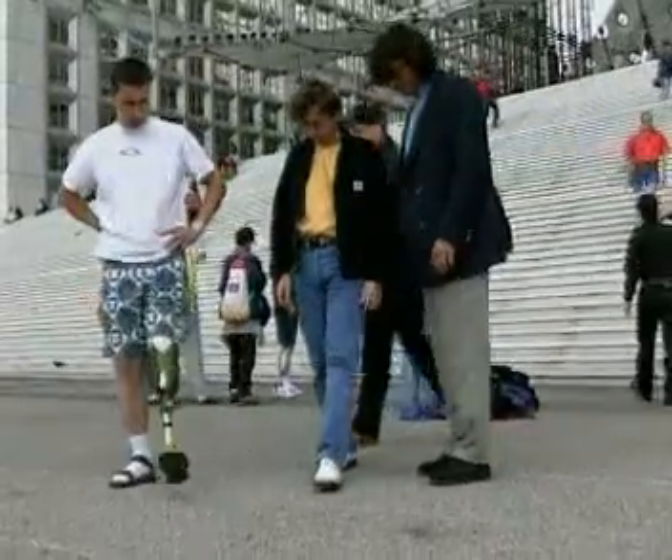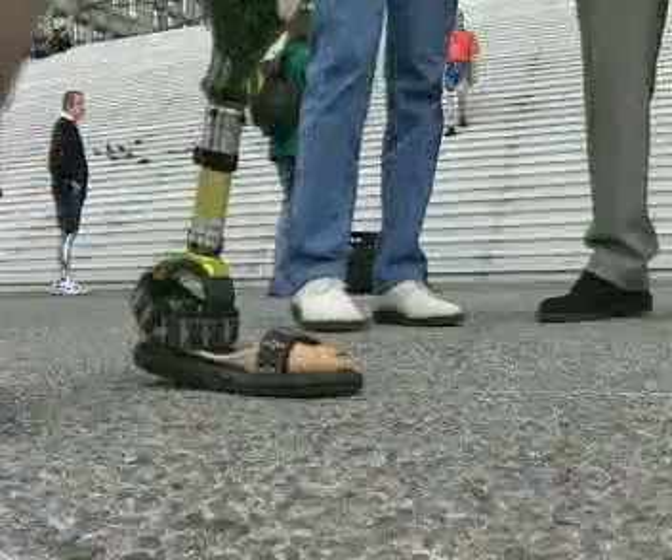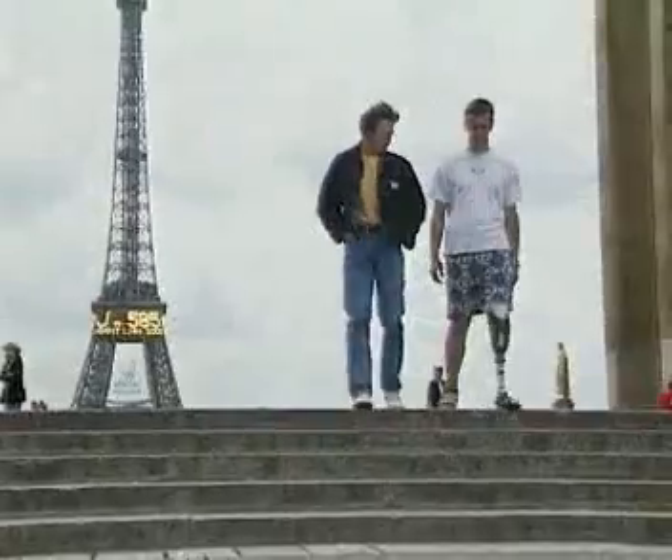This concept by French prosthetist Pierre Chablot has resulted in an energy efficient, comfortable prosthetic foot which has been clinically tested in the inventor's home country.